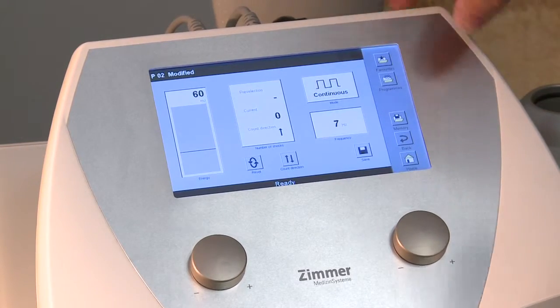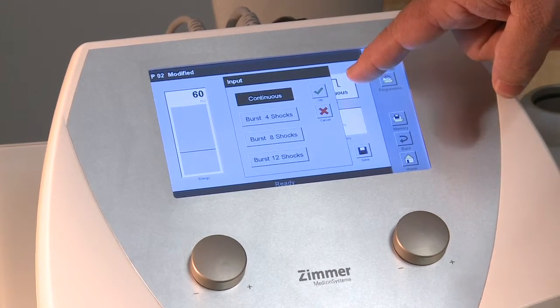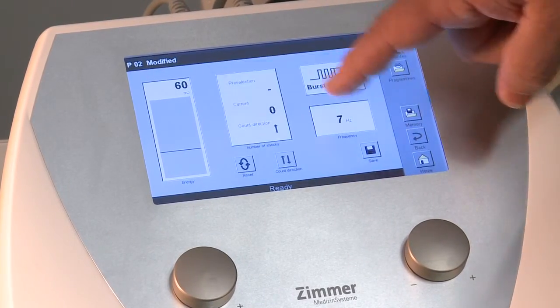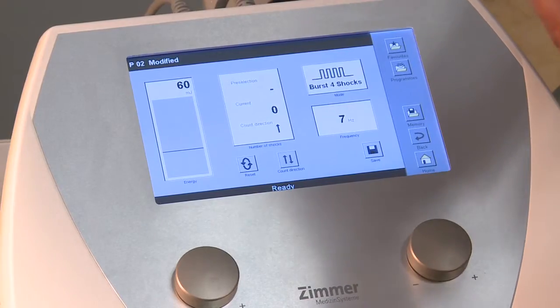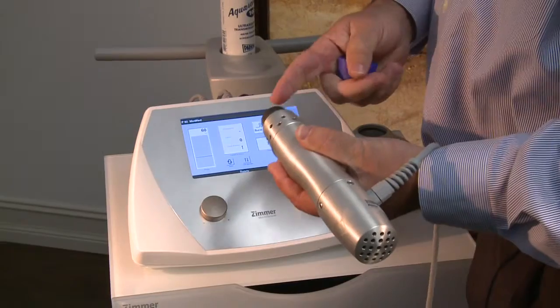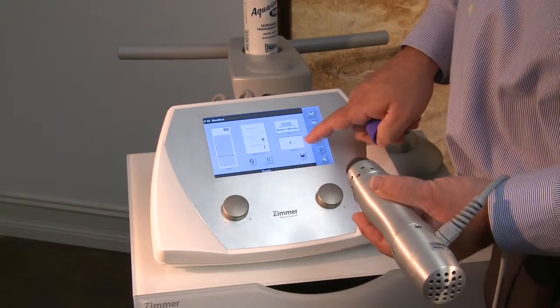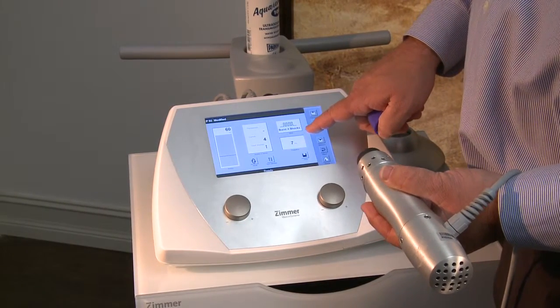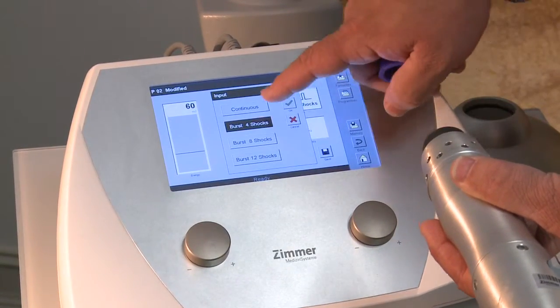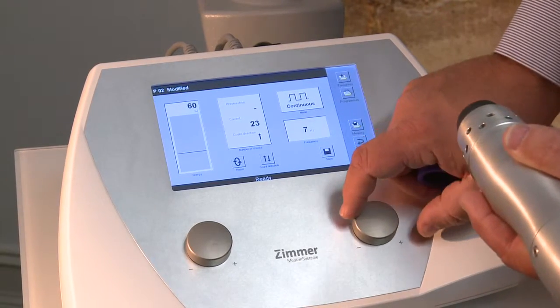One other feature which is not commonly used but is available is the burst mode. You can set it up so that it fires four simple bursts and then stops. The device cap — the cap on the tip — can either be used with or without it on. In burst mode it delivers four pulses and then stops, and you repeat the action to continue.